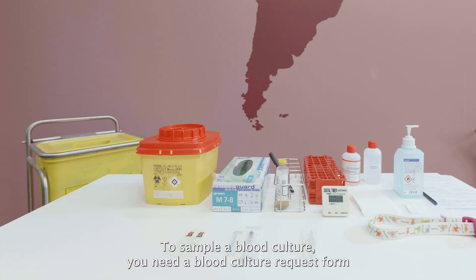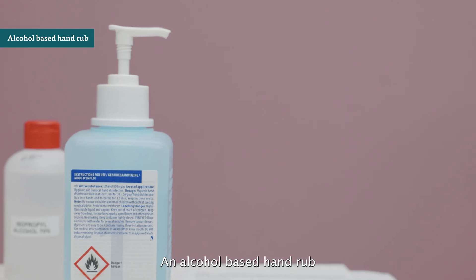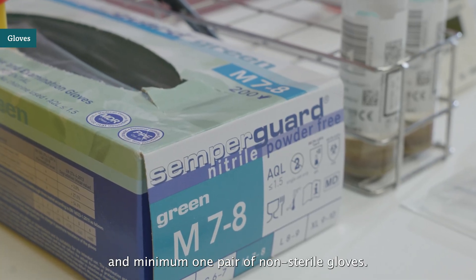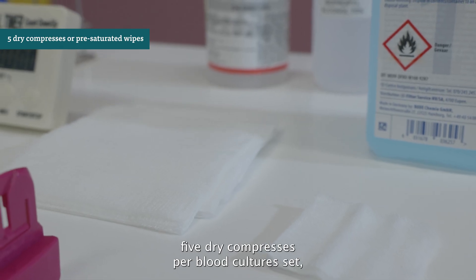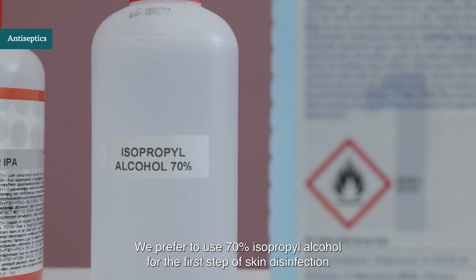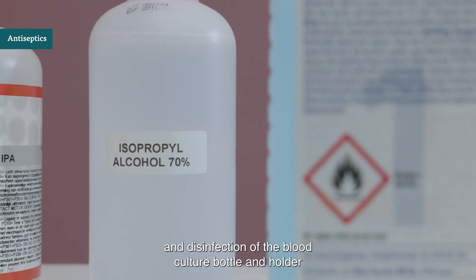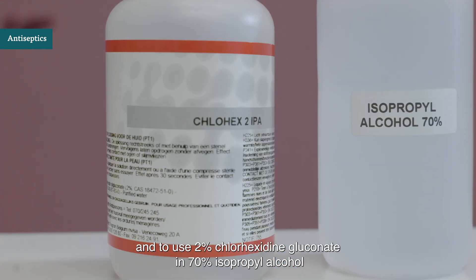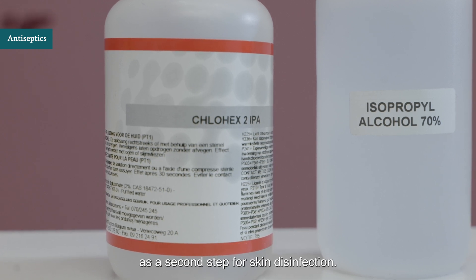To sample a blood culture, you need a blood culture request form, a permanent marker and a pen, an alcohol-based hand rub, and minimum one pair of non-sterile gloves. For disinfection, you need a timer, five dry compresses per blood culture set, and two disinfectants. We prefer to use 70% isopropyl alcohol for the first step of skin disinfection and disinfection of the blood culture bottle and holder, and 2% chlorhexidine gluconate in 70% isopropyl alcohol as a second step for skin disinfection.